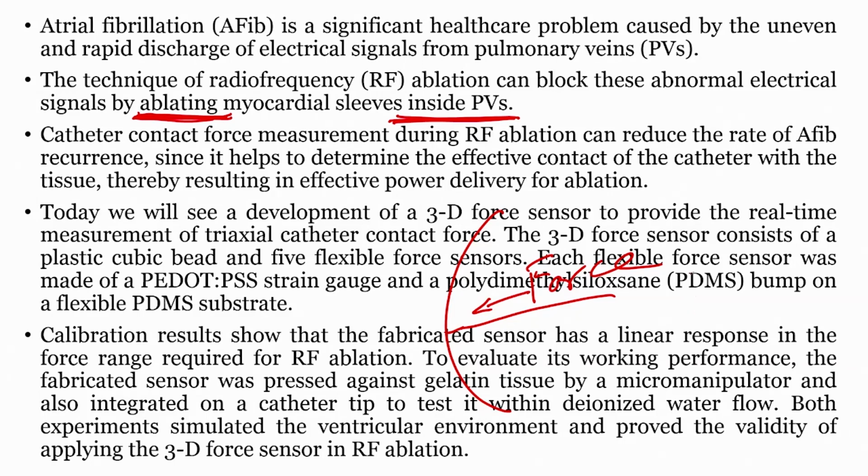If the force is more, then the regions which do not need to be ablated will also get ablated, and if the force is less, then the recurrence rate would be higher. So, force sensing in catheter ablation is extremely important, first thing.